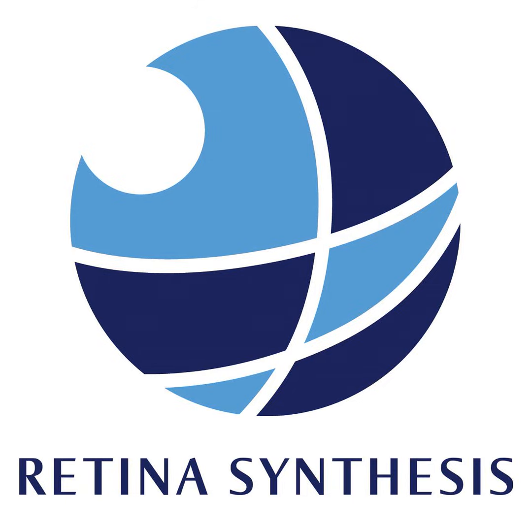So you can actually look at the different layers of the retinal vasculature, the superficial and the deep, and the choriocapillaris, and even out to the choroid nowadays with the swept source devices that have deeper penetration. And it's really just changed the way I think we look at retinal vascular disease, everything from neovascularization elsewhere in retinal diseases, to choroidal neovascularization in diseases like AMD. It's changed the way we look at those diseases. What are the common applications of OCTA?